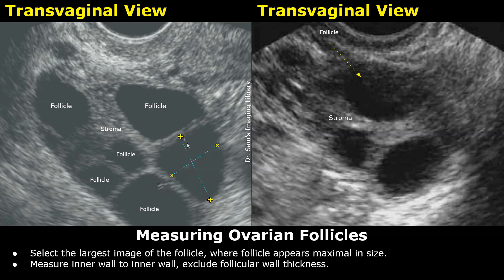Next, we place the calipers inside the follicle, measuring from inner wall to inner wall. We deliberately exclude the follicular wall thickness. This is because the clinically relevant measurement is the fluid-filled diameter, not the thickness of the follicular wall. Including the wall would falsely increase the follicle size and lead to inaccurate assessment of follicular maturity.